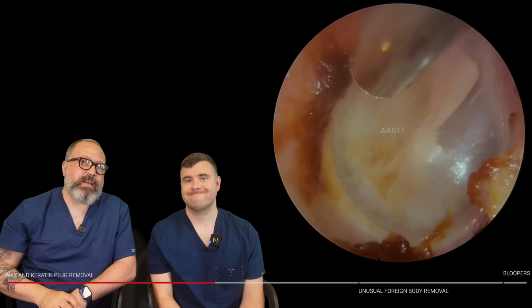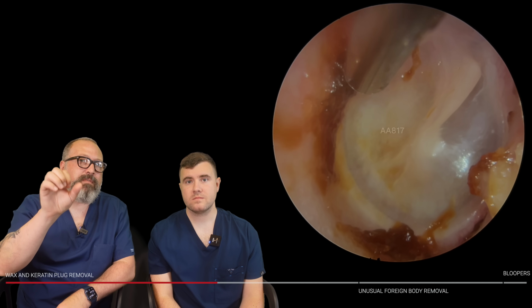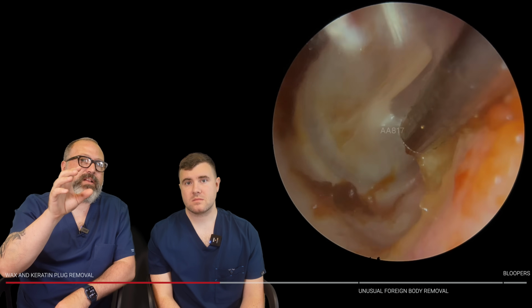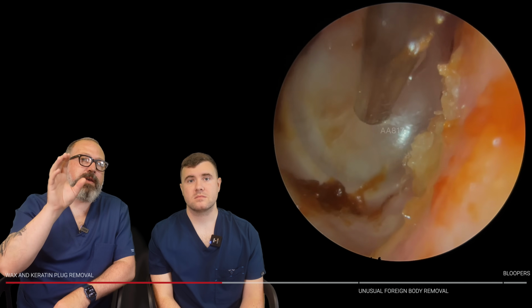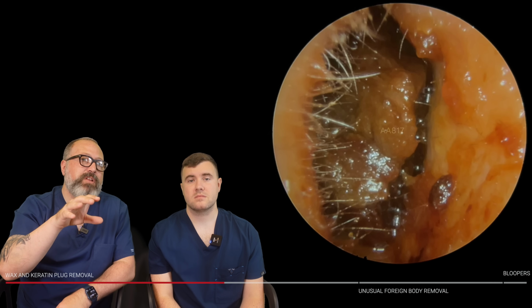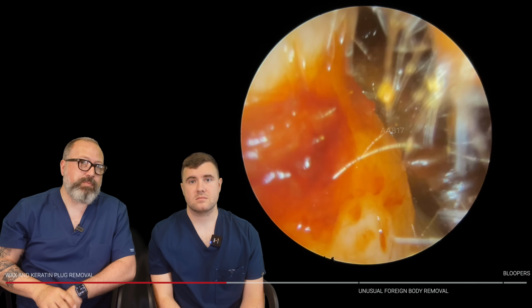Not an easy one to get away, and this is the really sensitive part of the ear here. It's very, very sensitive. It's right on top of bone. This is actually surrounded by the skull. So I'm just going to clip this away. We've exposed the eardrum. We can see there we've got rid of the problem. The rest of this now, lots of olive oil going in over the next couple of days just to soften those last pieces. Next bath or shower, they're going to come out on their own. But eardrum looking much, much better on that one.